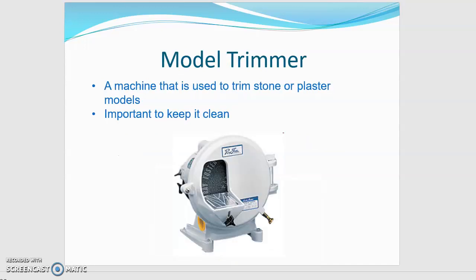The model trimmer, we have used this. All of you have used this by the time you'll be listening to this lecture. Our model trimmers look fairly similar to this. As I reiterated in lab, I'm very passionate about keeping it very clean so that everything's staying in working order. So it's super important with these trimmers to make sure that water's running enough so that the plaster is being washed away from the sanding disc as it's going. And once that sanding disc is caked up with plaster, it's not going to be as effective anymore.